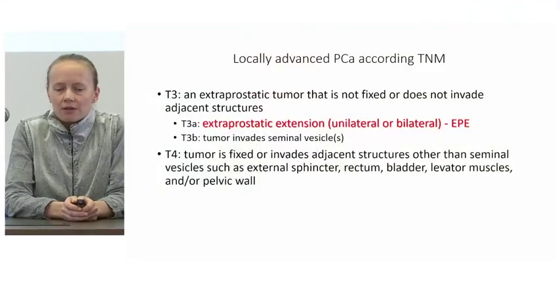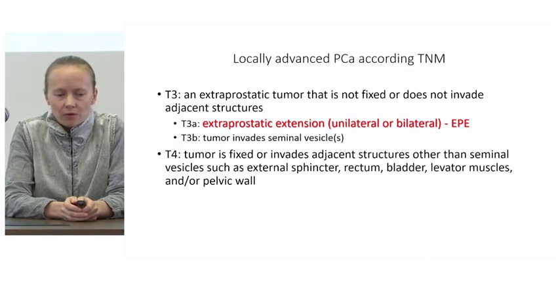I'm representing here the biggest company for radiological imaging in Lithuania. It's Afidėja Lietuva. And my talk is about MRI diagnostic of locally advanced prostate cancer. What we are going to talk about today is everything more than T3 on TNM, with the big stress on extraprostatic extension, called EPE.